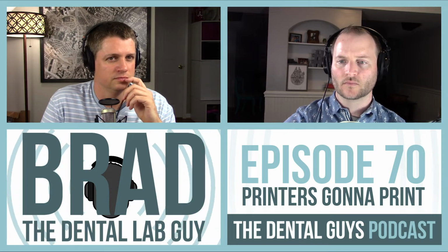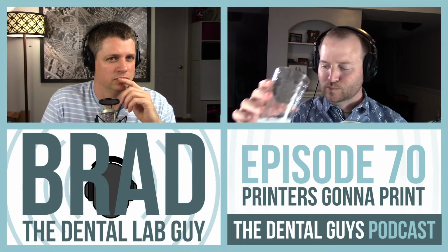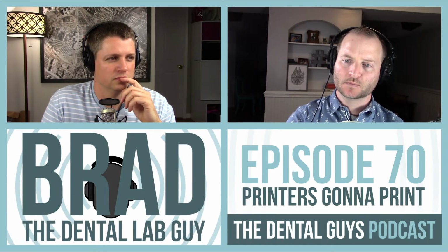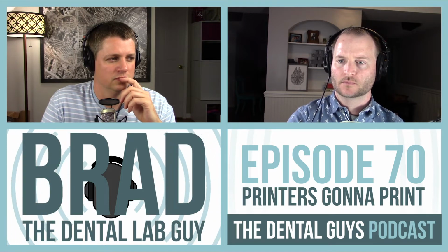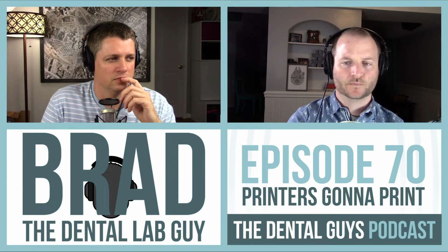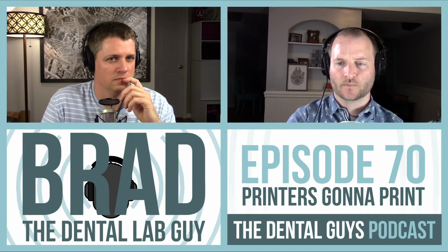It's not really the printer that's the issue, but you still have to encompass them in gypsum and cast that. There are some inaccuracies in the casting and burning out the resin that are challenges, again depending on how well you want your partial to fit. But you can print them. Fairly decent, because there are flexible clasps and some fudge factor in a partial. But that's really where we're at in our laboratory.